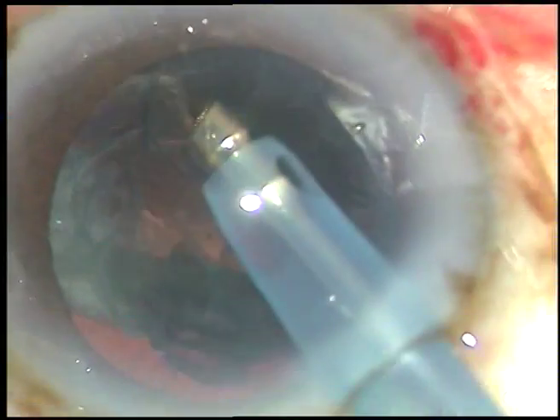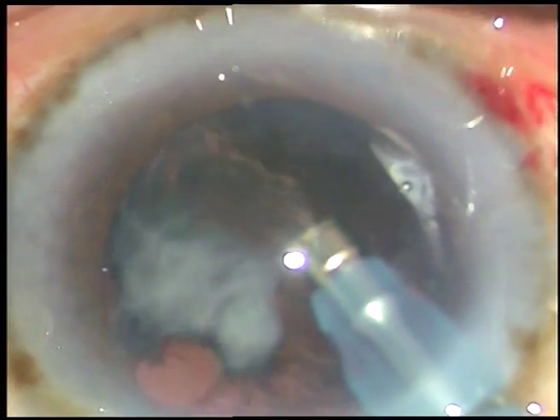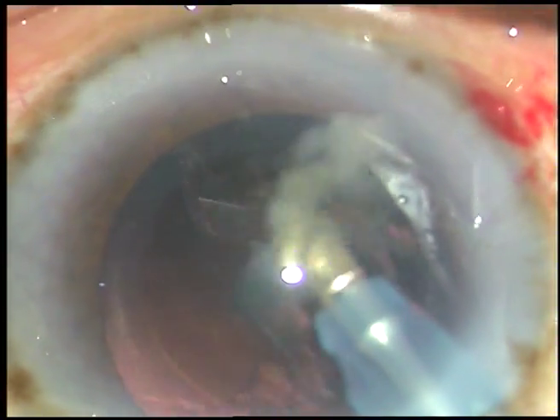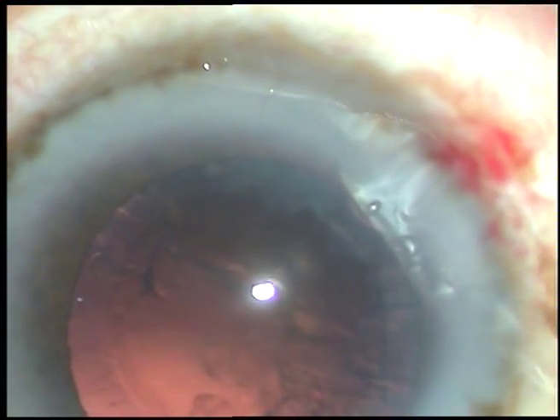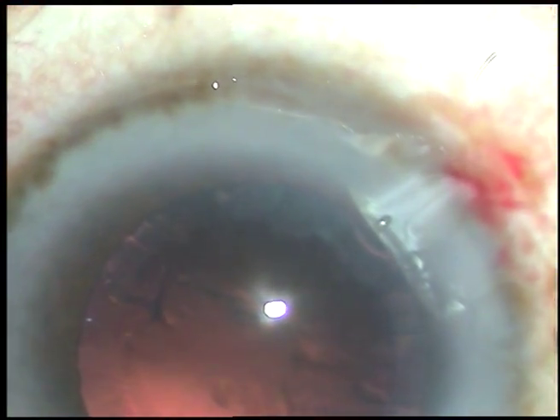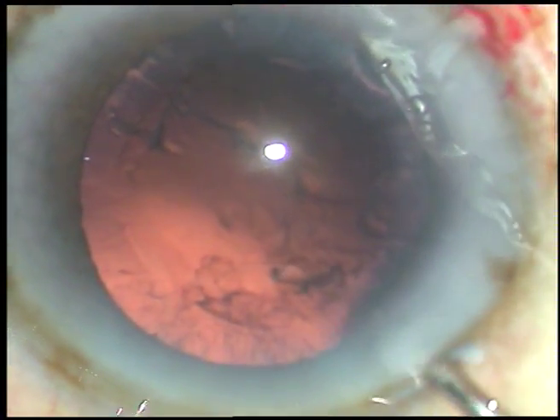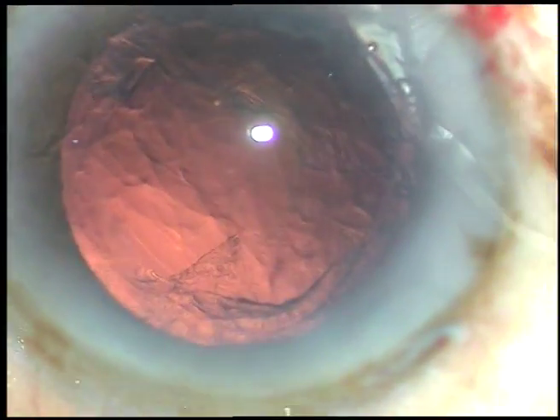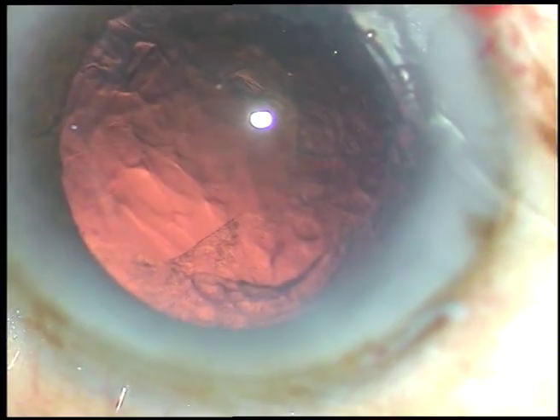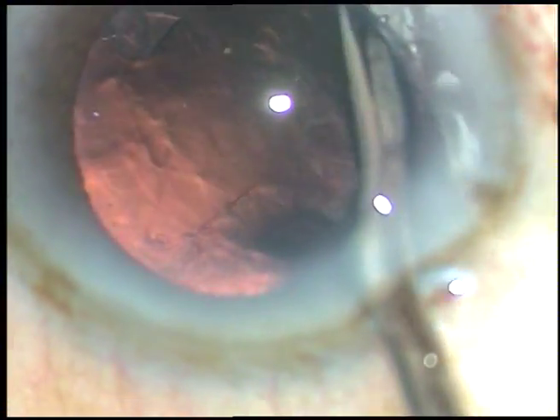This is the epinucleus — it is also coming off very well. The nucleus and epinucleus have been removed and now some cortical lens matter remains. Viscoelastic substance is injected again — it protects the corneal endothelium and keeps the anterior chamber formed while we remove this cortical matter.